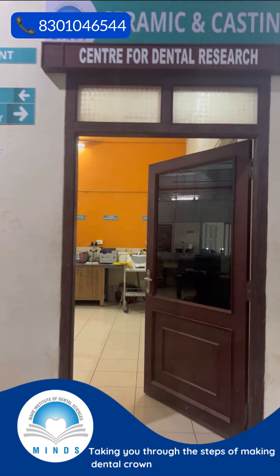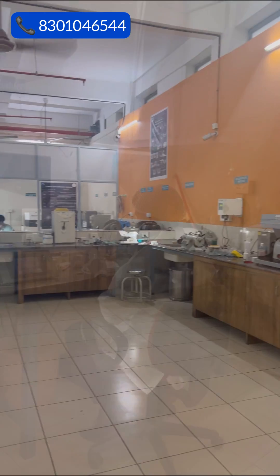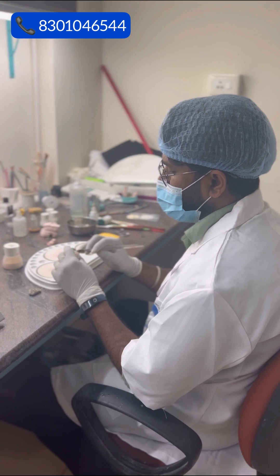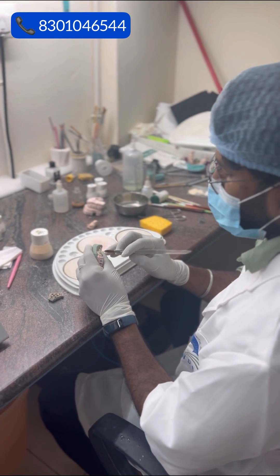Welcome to our dental laboratory, where precision meets artistry. Today we will take you through the fascinating process of creating ceramic dental crowns. This is where our skilled technicians combine science and artistry to create beautiful ceramic crowns.